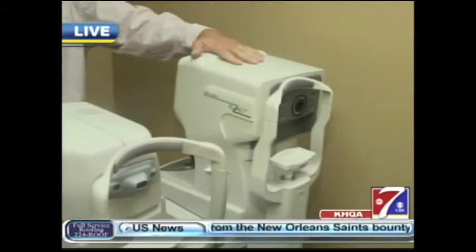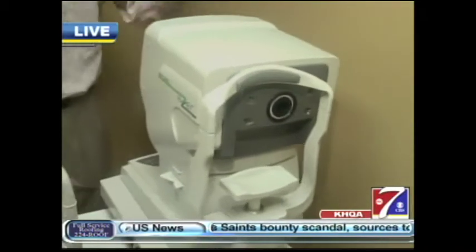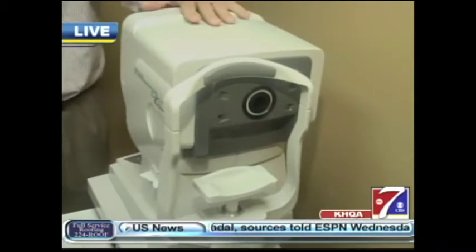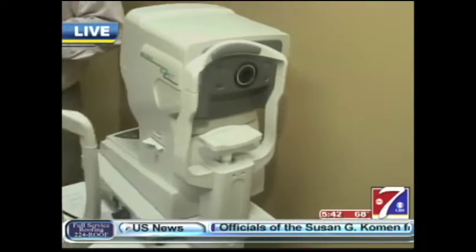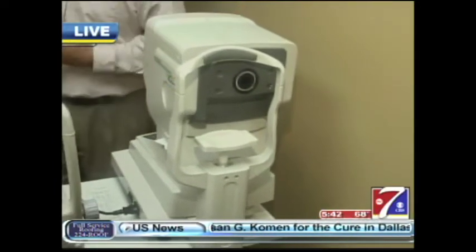So the first stop is the auto refraction machine. Basically, we sit the children down and have them look through the machine and get 3 different steps for a certain reading for the doctor, as well as a possible prescription comparison. So it's a starting point before you go into the other room. Yeah, they come back here with us, to get more comfortable with their environment. Being kids, sometimes it can be stressful not knowing what they're going into. So we make them comfortable before they have to go sit in the big chair with the doctor.